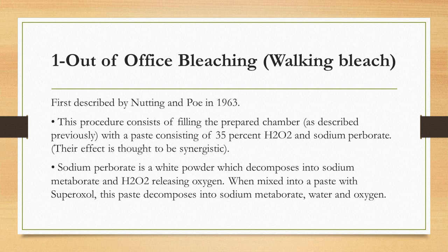The out-of-office bleaching. Again, we can clean the cavity in the same manner using sodium perborate, and the sodium perborate will release hydrogen peroxide, giving me oxygen. Sodium perborate is just a white powder which decomposes into sodium metaborate and hydrogen peroxide. The most important thing is the hydrogen peroxide.